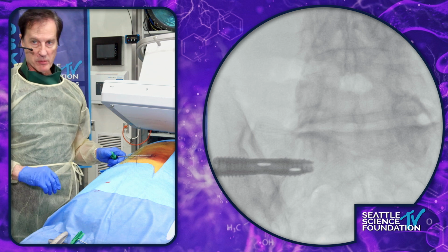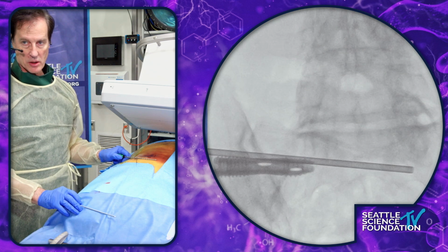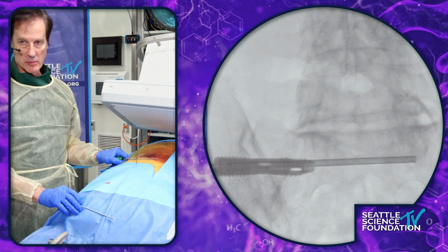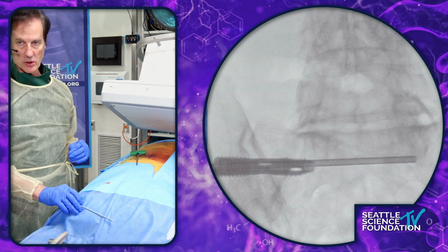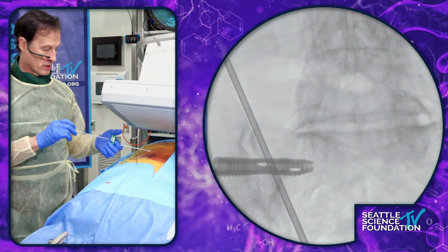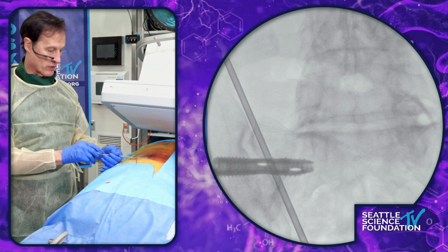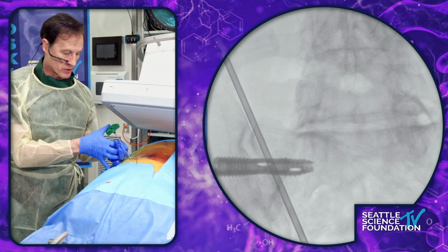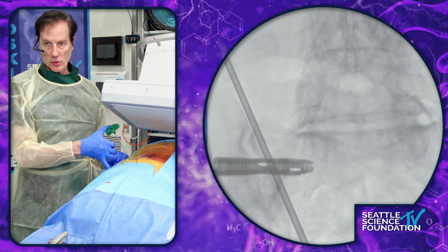I've made marks along the picture here, along the top of the S1, kind of mid portion between the S1 foramina, and then another mark along the border of the SI joint. I'm going to start right at that point, the intersection of those. So we're going to start out here, and this is more dorsal.